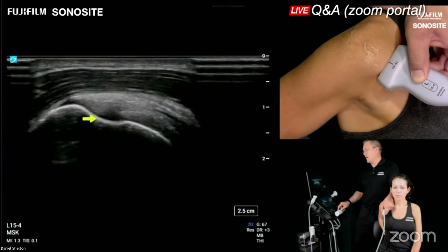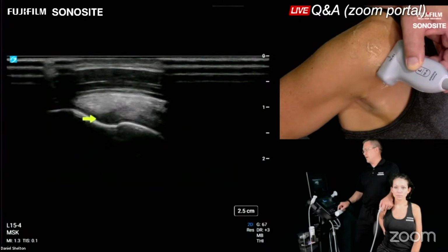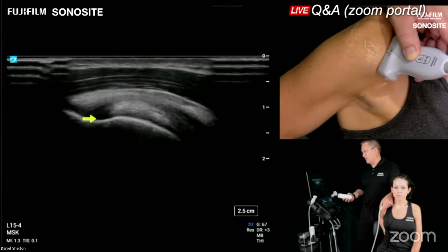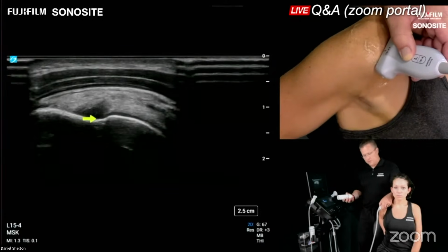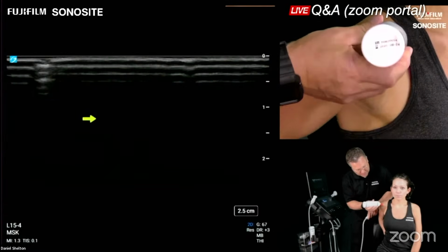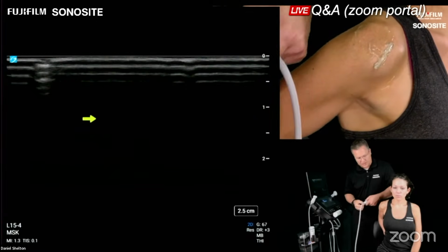So we did short axis, we did long axis. Make sure you're letting up on pressure so that you're not collapsing any pathology. That's also very important. When I'm doing these and I suspect a big tear or even a subtle tear, if I see something that looks like it may collapse, I'm just going to let up pressure, and I can see where the gel was on the shoulder, or where it's not, because my probe was pressing down, and I put down a bead of gel right on that square.